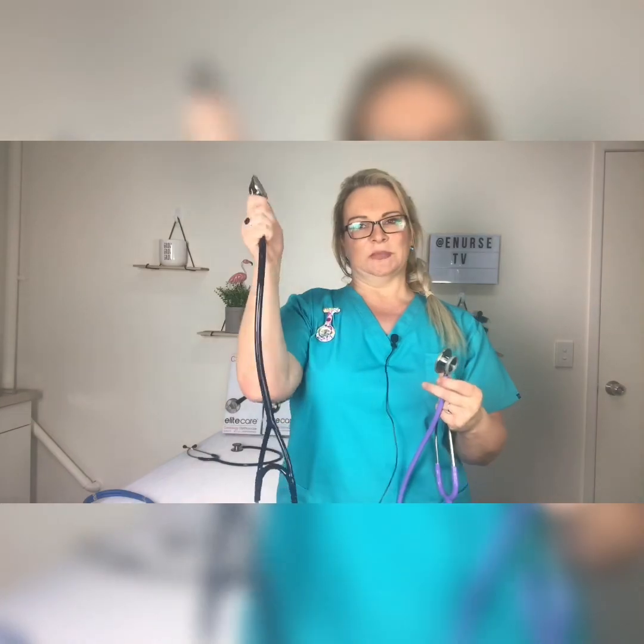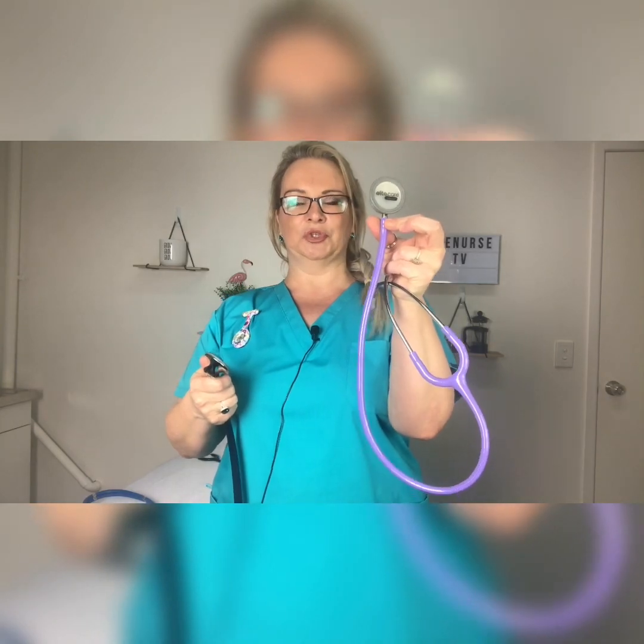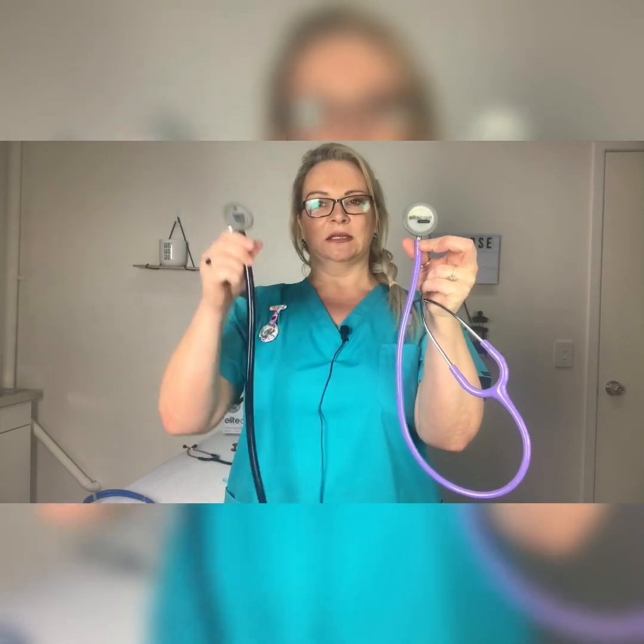The tube tends to be a little bit thicker in a cardiology as opposed to your standard regular. Some regulars have thick tubing as well, and the reason the tubing is thicker is there's a dual lumen inside. While we can only see a single tube, there are actually two lumens that run all the way from the diaphragm — they bifurcate and go up to each of the earpieces. Having two tubes makes the acoustics just that much better quality.